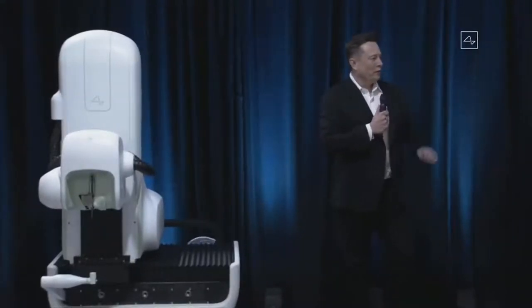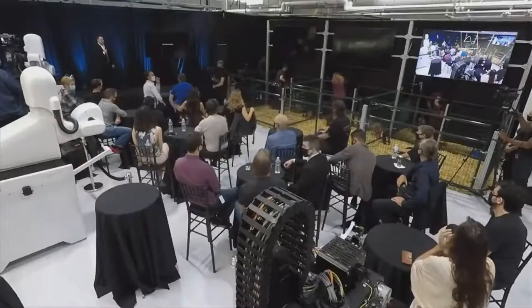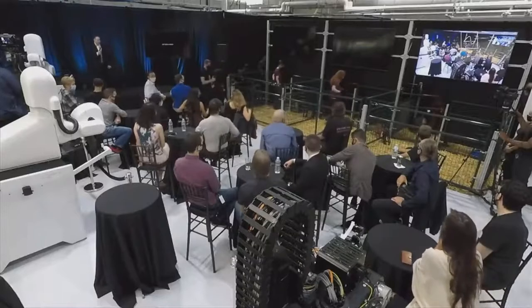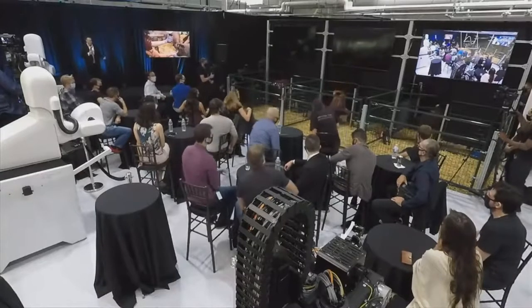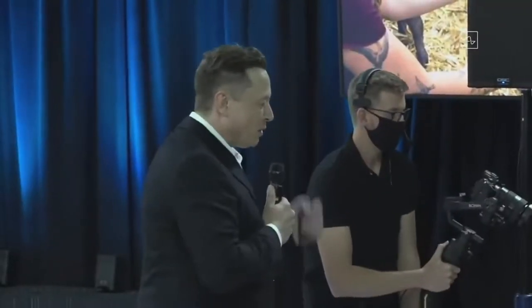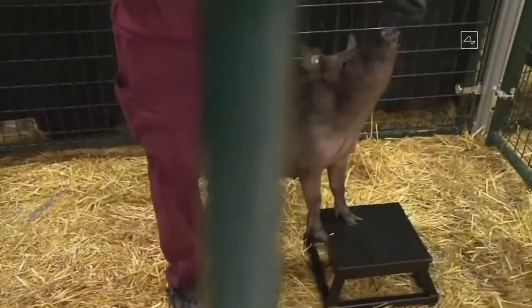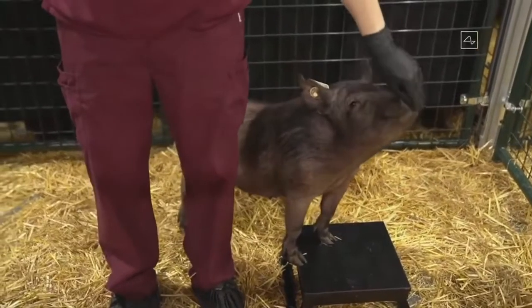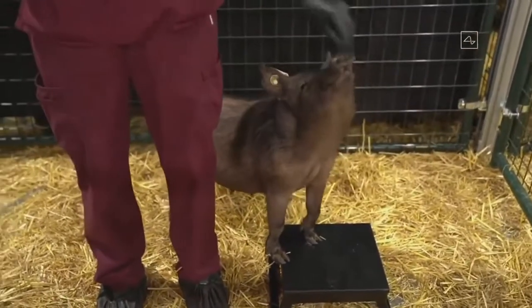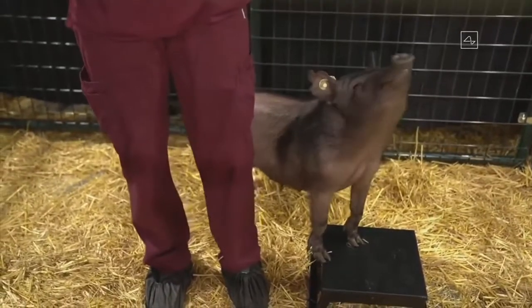We're bringing out the pigs for what I'm calling the three little pigs demo. In pen number one is Joyce, and she does not have an implant — obviously healthy and happy. And this is how you know it's a live demo.